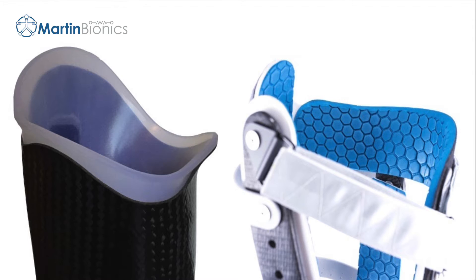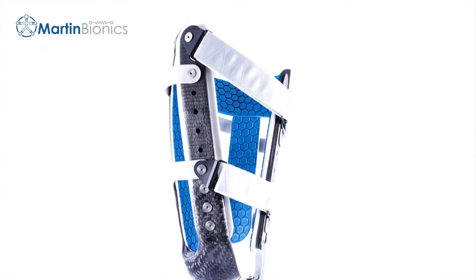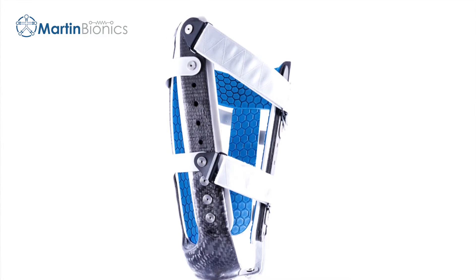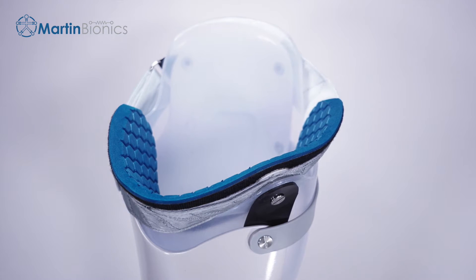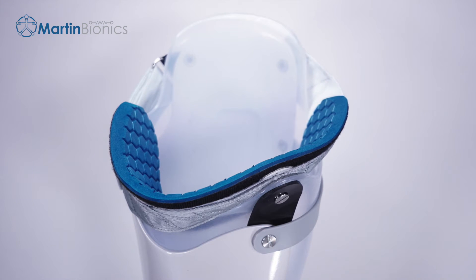Discomfort of the brim is a major complaint of transfemoral users. Even a small change in limb size results in excessive pressure in this ultra-sensitive part of the body. We understand that not all users may have immediate access to getting a full new socket due to payor source limitations. So we created the Swing Brim.